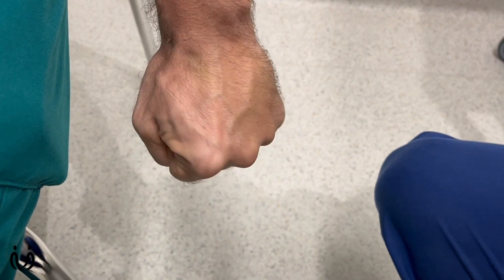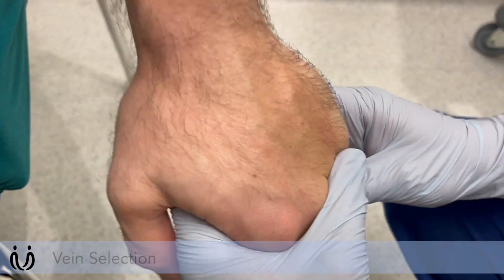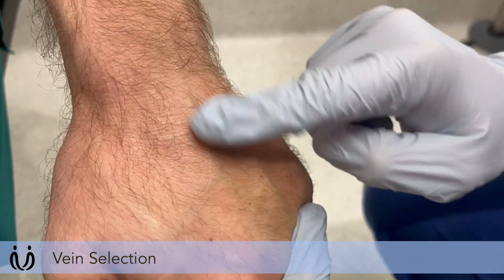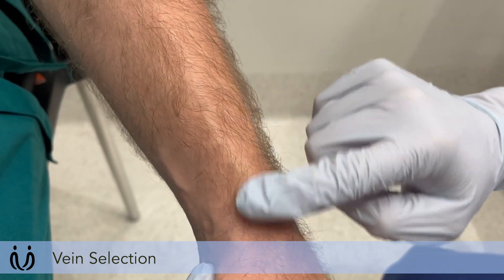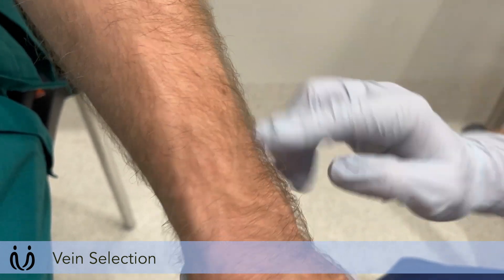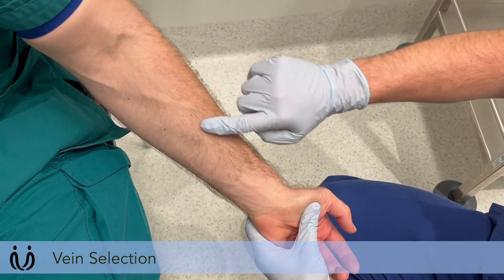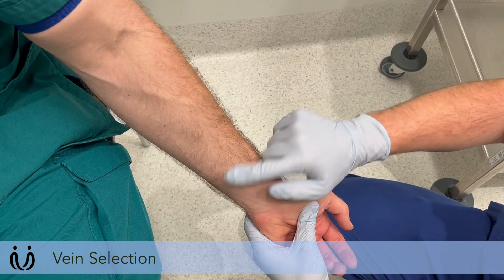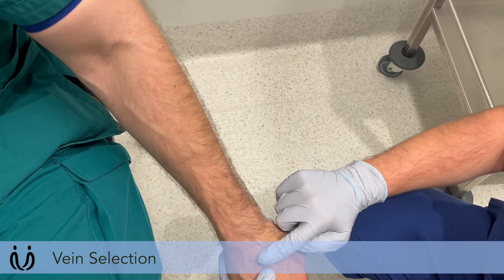That's good, you can relax. So as we're looking at the veins, often the best spot is the dorsal venous network of the hand — there are a couple of nice veins here. Otherwise you've got a vein on the medial aspect of the wrist and some running up the anterior forearm. I'd avoid the wrist on this side because it's quite painful and the veins are quite small.